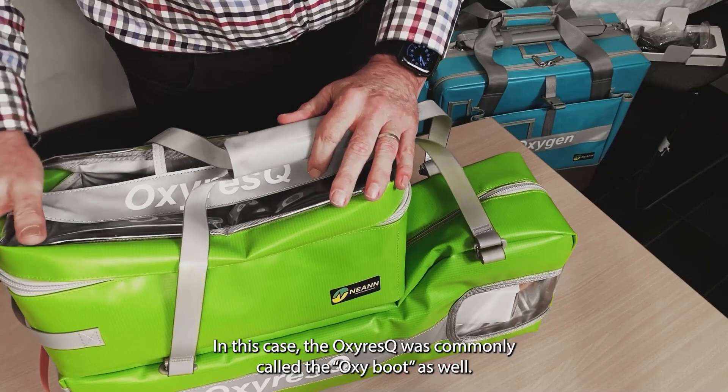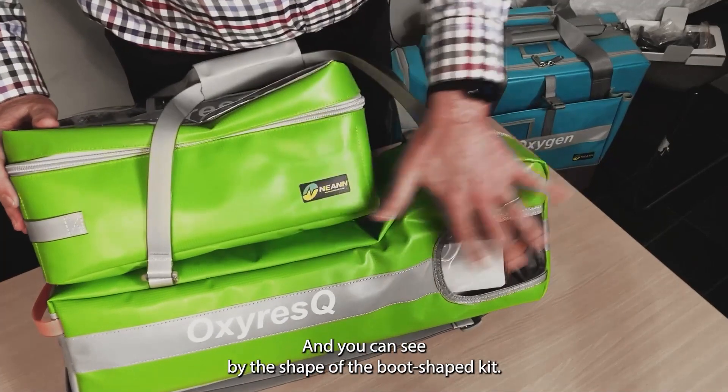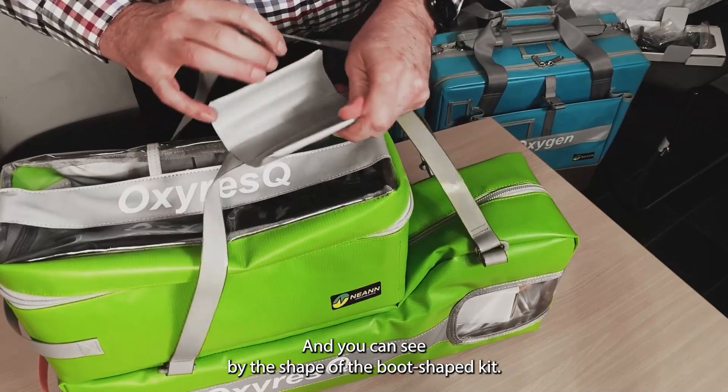It was commonly called the Oxy Boot as well, and you can see by the shape — especially the base kit — that it is boot-shaped.